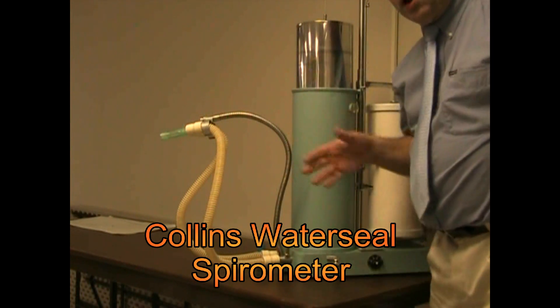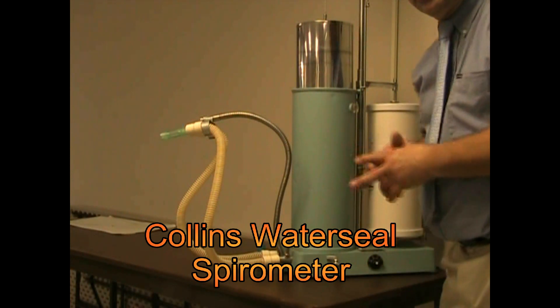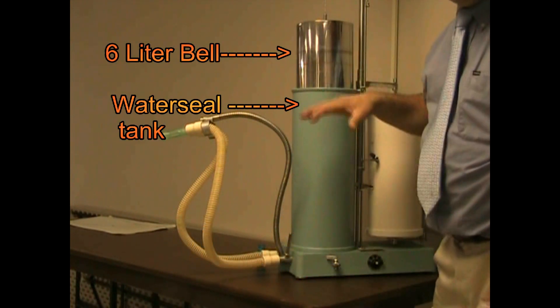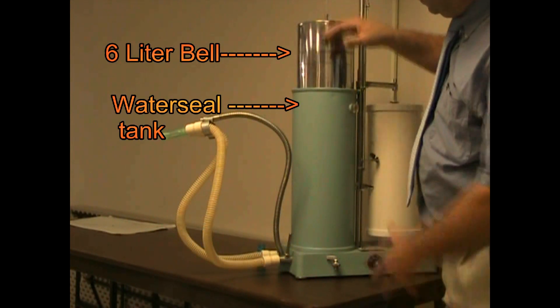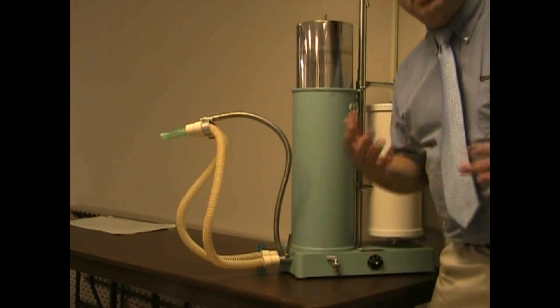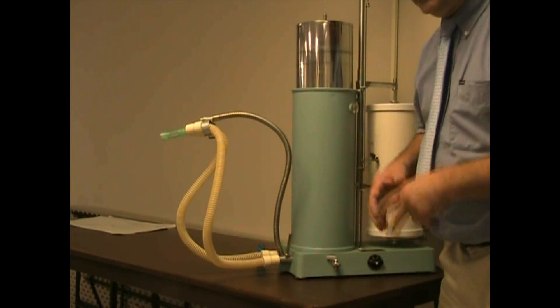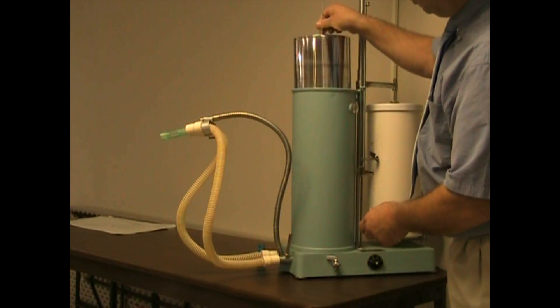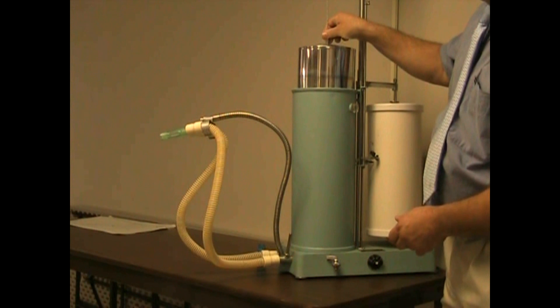This is a Collins water seal spirometer. It's probably the gold standard of all spirometry. We have a six-liter volume container that is sitting in a column of water, and the water acts as a lubricant and a seal to allow the bellows to go up and down easily.